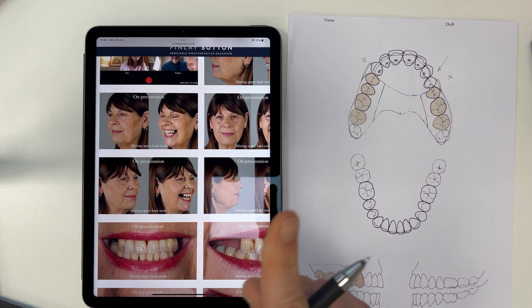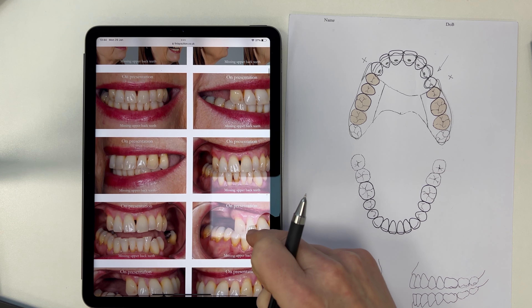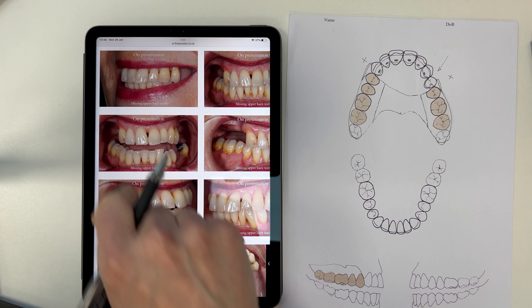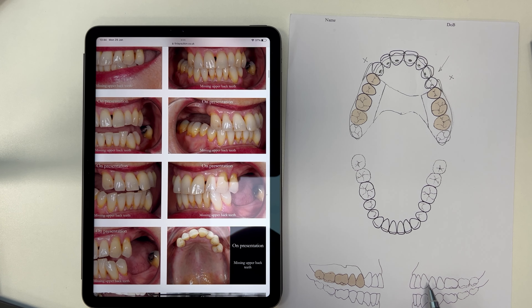I'm just in the surgery and doing this at lunchtime for you — Claire's just walking around in the background, don't worry about that. I've got a patient coming in about a quarter of an hour. Now I'm just going to do this other side too.